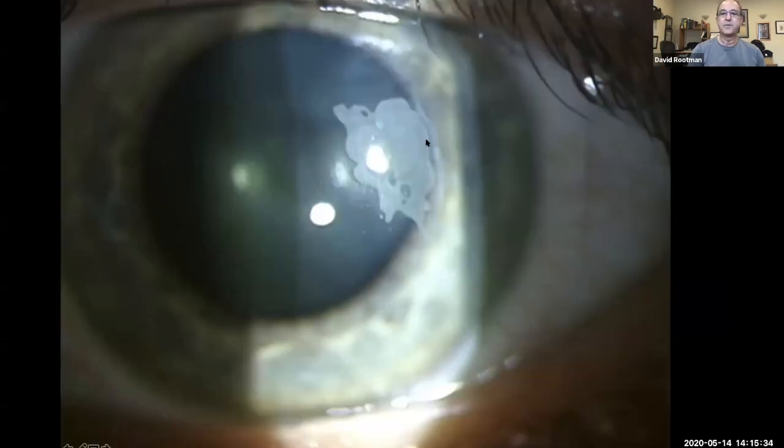Here's another view of this island of whitish material. And this is at the interface of the flap and the bed. And if you look here, that is probably the edge of the flap, which should be actually over here. So there's been significant displacement of the flap. And with the wide beam, it's hard to see the striae, but you can imagine where they are.